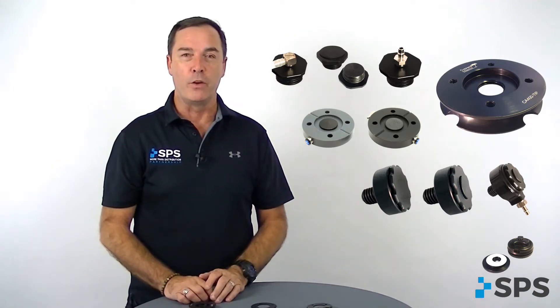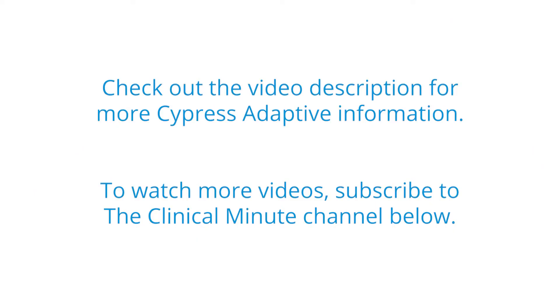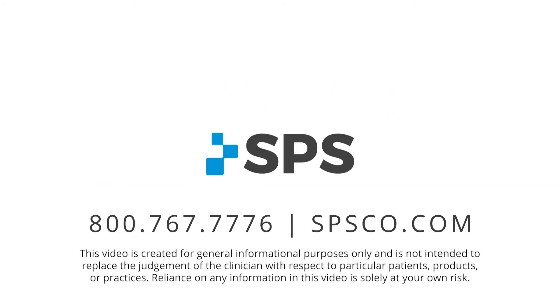That is a quick overview of the Cypress adaptive valve and valve plates. Search for additional videos on the specific valves you'd like to learn more about. This has been the Clinical Minute. For additional videos, visit spsco.com/clinicalminute.